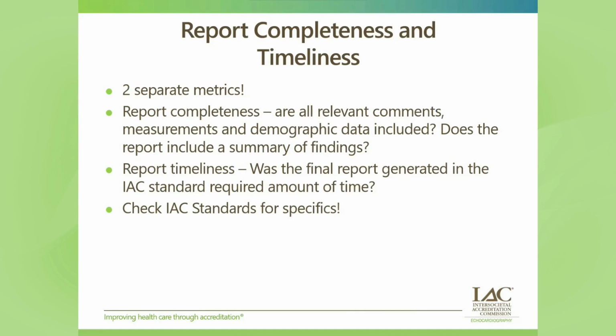Make sure you are looking at our IAC standards for specific turnaround time requirements. Your facility may have a higher benchmark than we do, and that's okay too. So just as long as you're at least meeting the minimum IAC standard required amount of time, you're in good shape. So was that report generated in the IAC standard required amount of time? If you need assistance with that, we can show you where to find that in the standards.